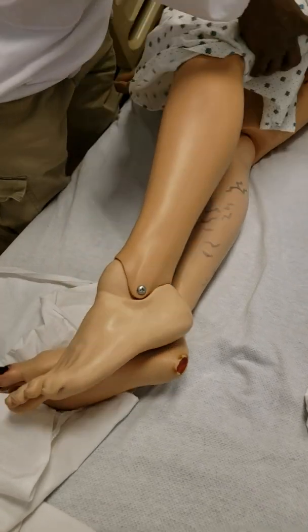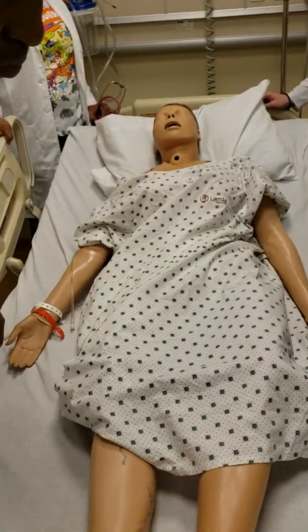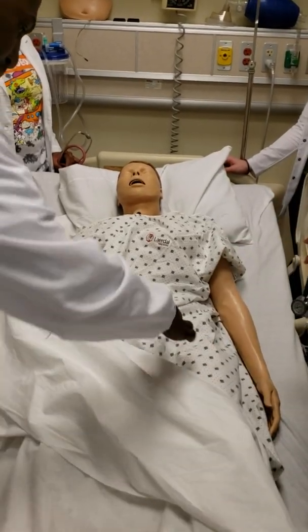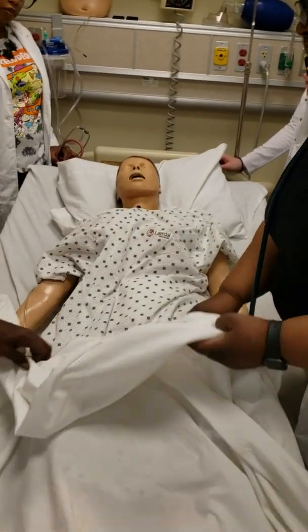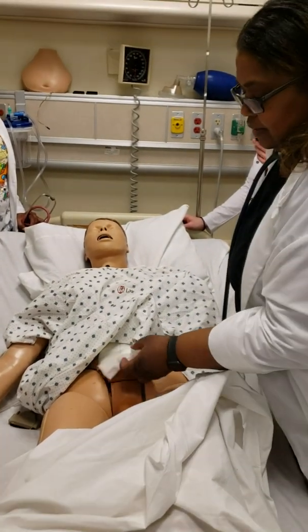I'm laying back. And then they say, oh, pull the card. Got to put on a 40% Venturi mask, and I'll put on a 40% Venturi mask on the patient, whatever card you pull. Hold on. And then, you should bring measuring tapes. No. There's one on the table over there.